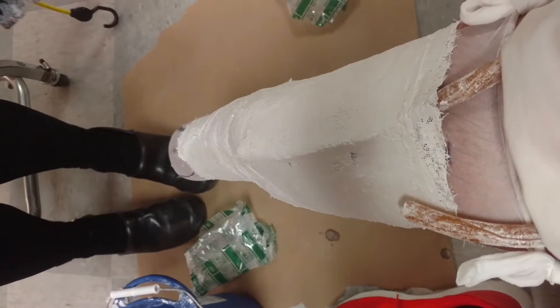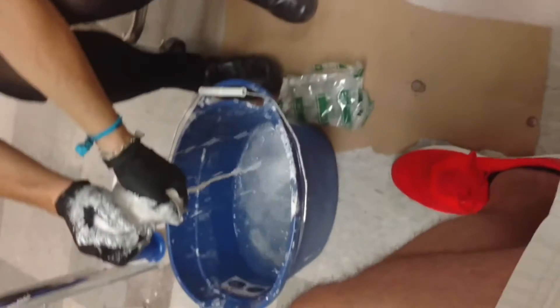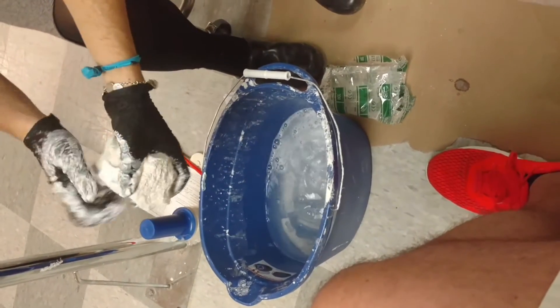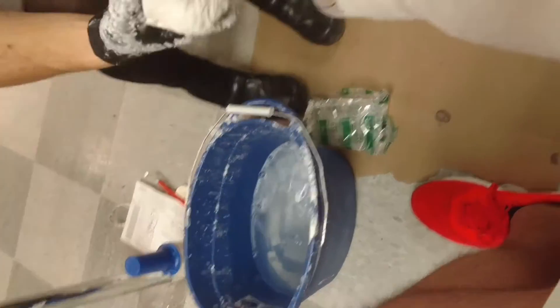We'll do more of that for the socket when you come back and I cast you on top of this liner. It averages about two weeks. But with the holidays it might be a little bit longer — it's almost Christmas.